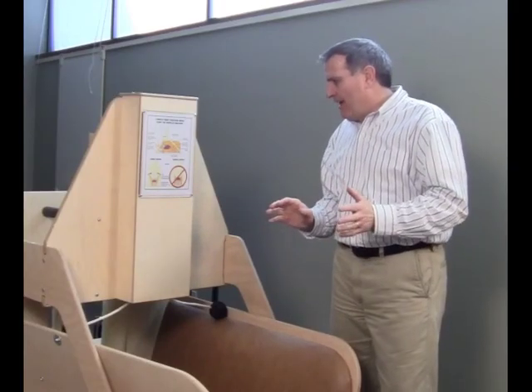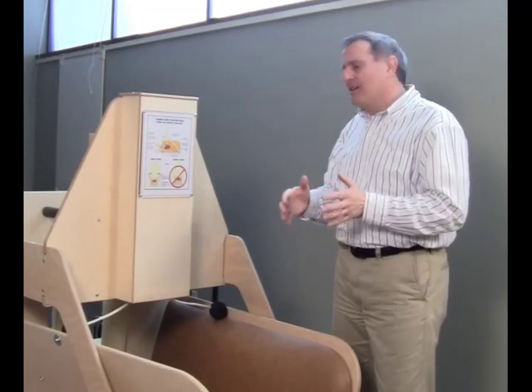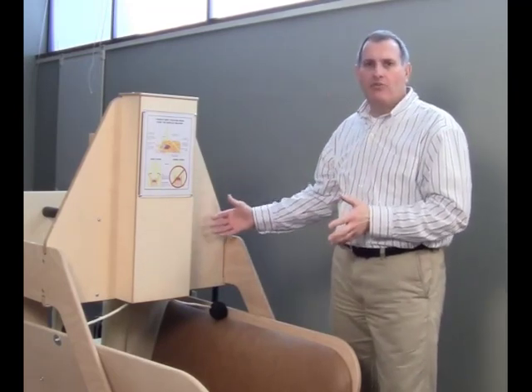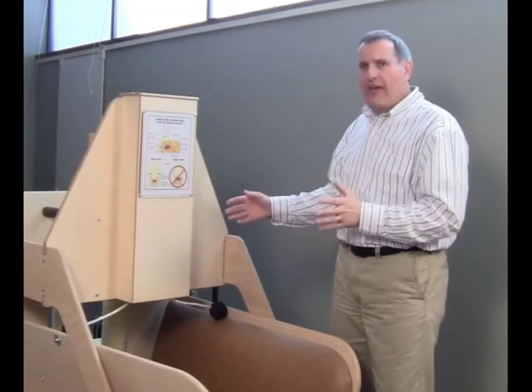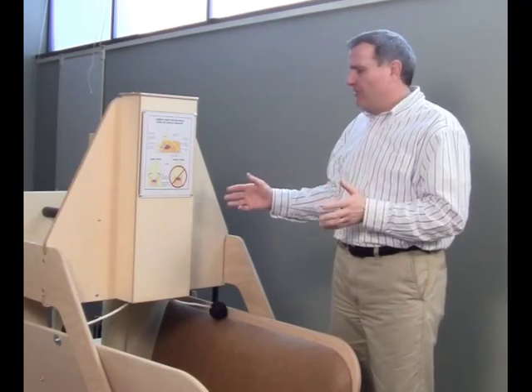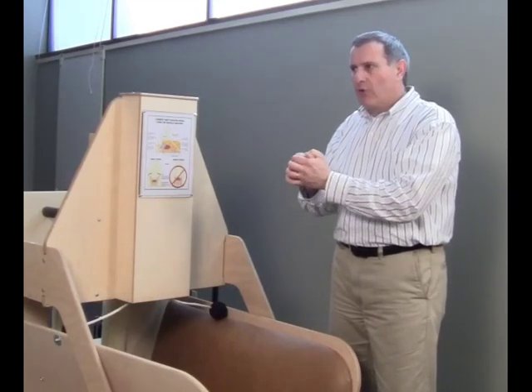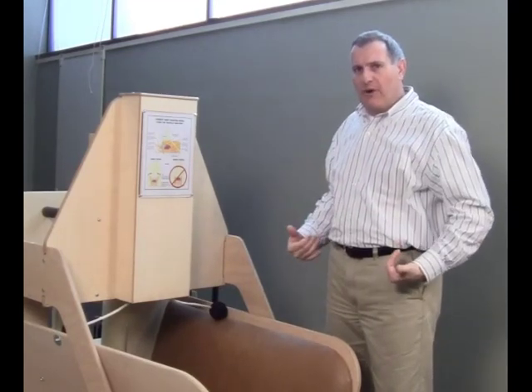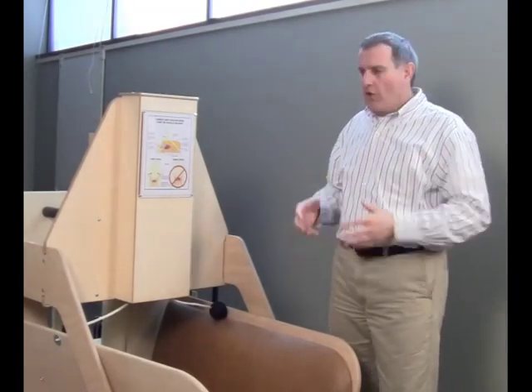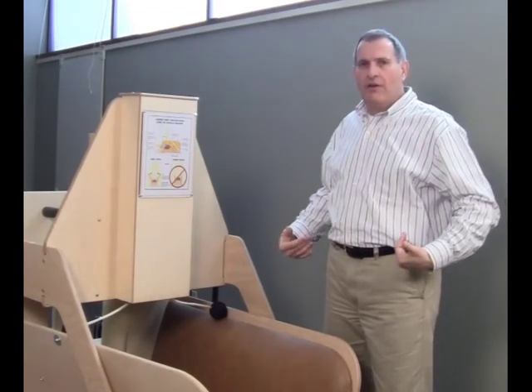The other thing is the ideal time frame for this is not just 2 minutes or 3 minutes, but obviously it's going to take some time to grow in the length of time an individual will stay in the machine. So don't feel like it's a failure if they only get in it for a couple of minutes at the beginning and they're out. Ideally, we'd love for them to stay in there for 15 minutes and have a deep calming effect on their nervous system. The other thing is, if they continue to hold the lever constant for a long period of time, the body will habituate to the pressure and it'll just kind of feel like nothing. So varying the pressure, pulling and releasing, will actually have a greater physiological benefit.